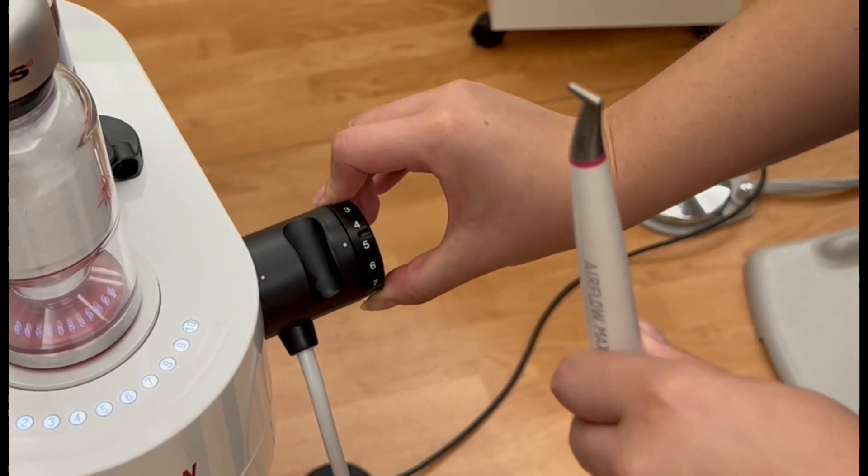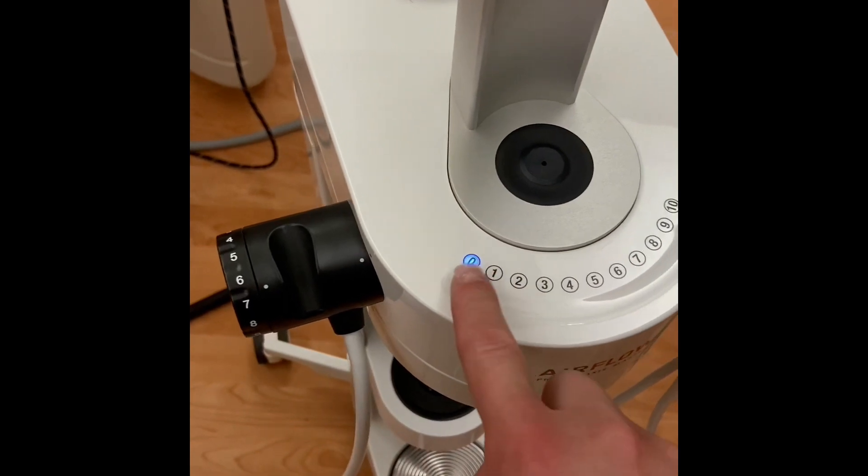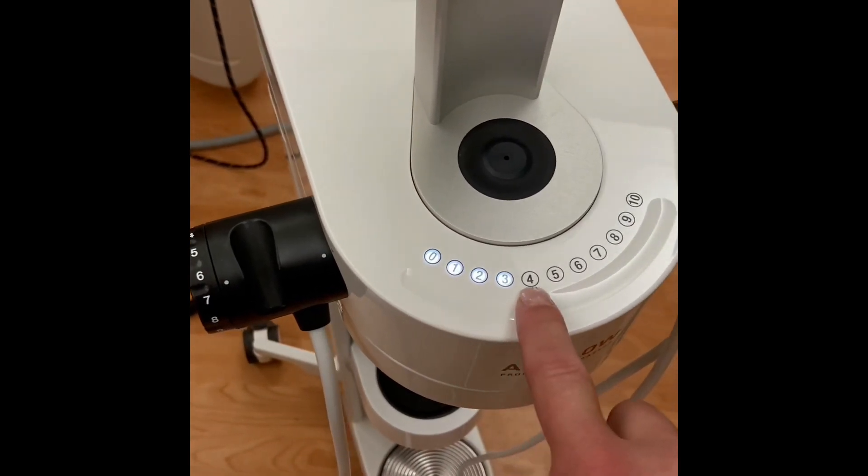Water flow is adjusted by using the dial on the side. The powder velocity setting is adjusted by using the touch screen on the unit.